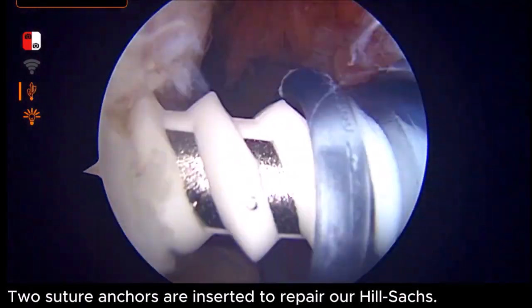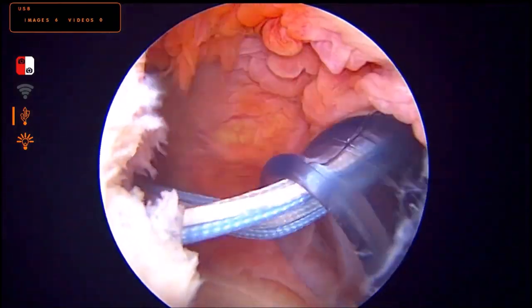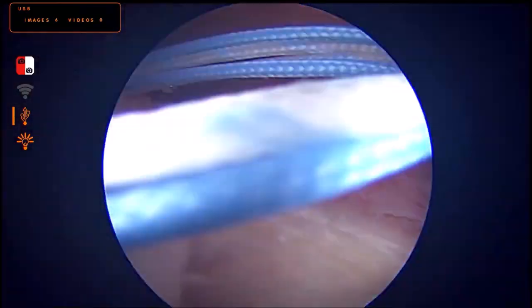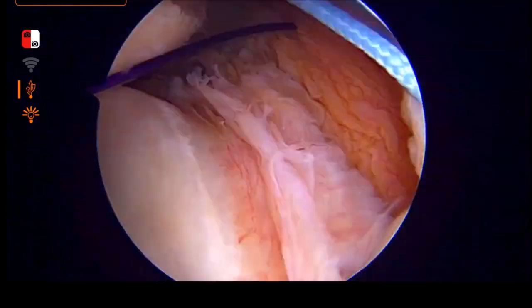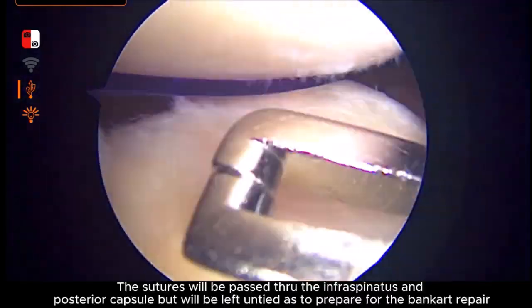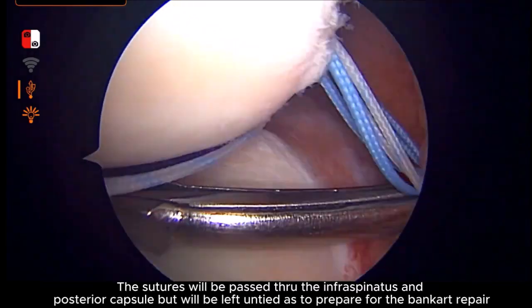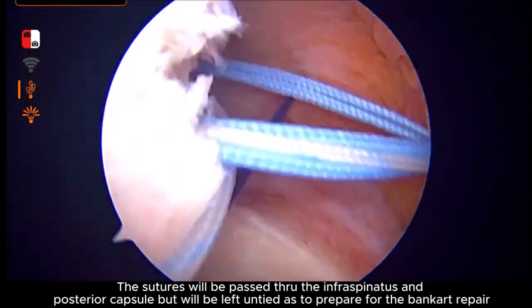Two suture anchors are inserted to repair our Hill-Sachs. The sutures will be passed through the infraspinatus and posterior capsule, but will be left untied in preparation for the Bankart repair.